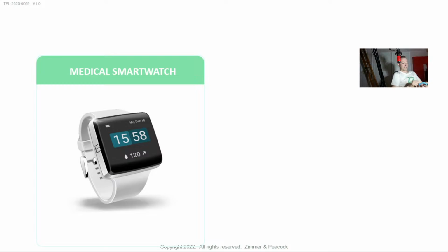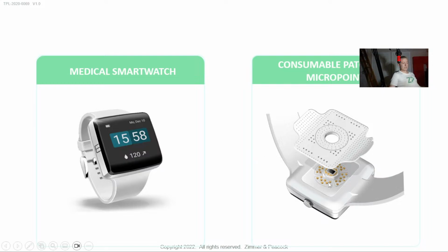These microneedles, it's the nice thing about having the strap, it pulls the microneedles into the body. And that means we can essentially deliver our microneedles into the interstitial fluid. Let me illustrate this with a few examples. This is what the setup's like. You've got electrical contact here.